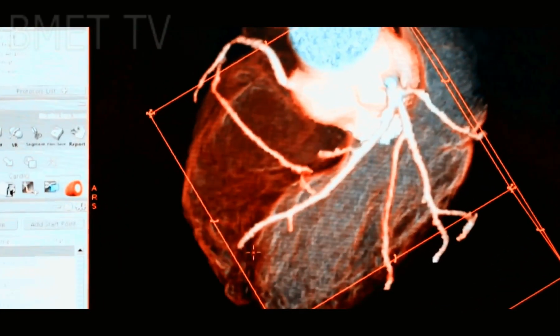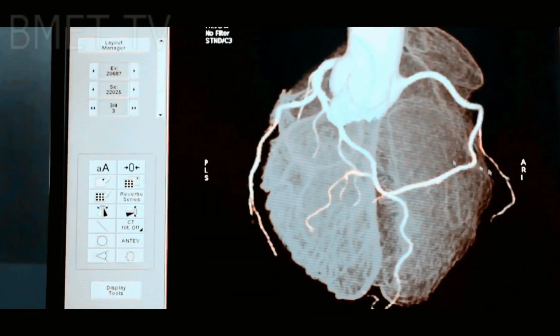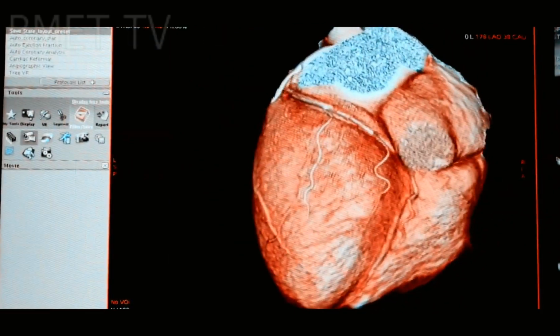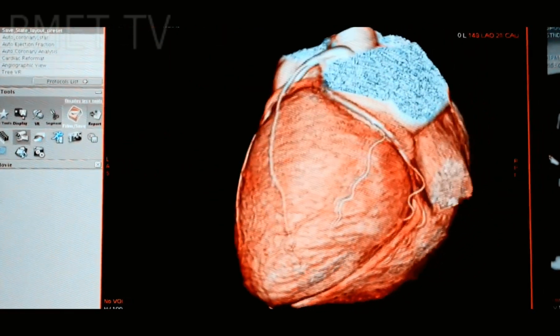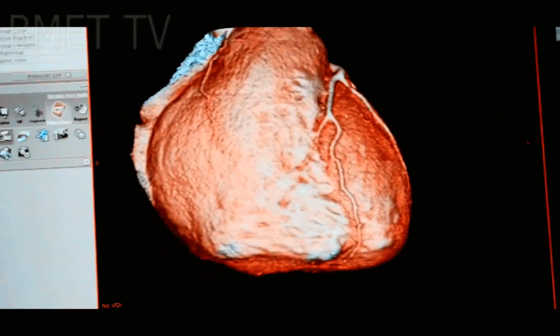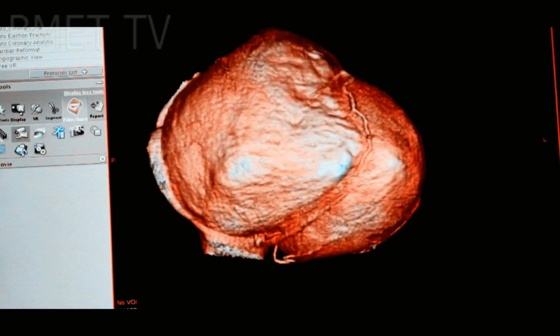Let's look into different kinds of CT scans. CT angiography. A doctor might order a CT angiography or angiogram if they want to assess a person's risk of heart disease. The scan can also help doctors detect damage to the blood vessels such as aneurysms or blockages. Before the scan, a health professional injects dye into the blood vessels to help make the flow of blood through the body more visible. A CT technologist then takes images of the blood vessels.